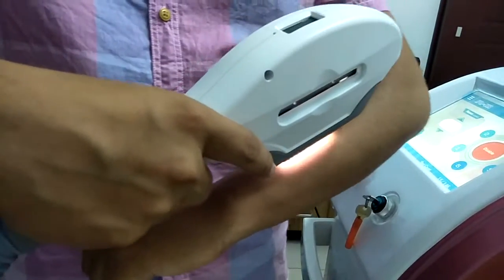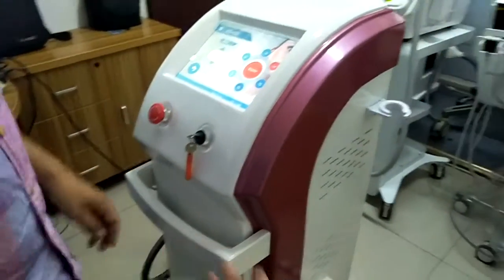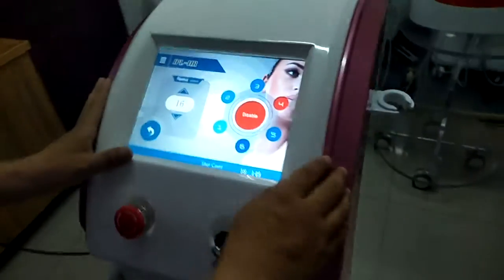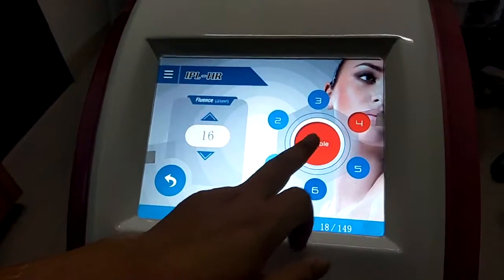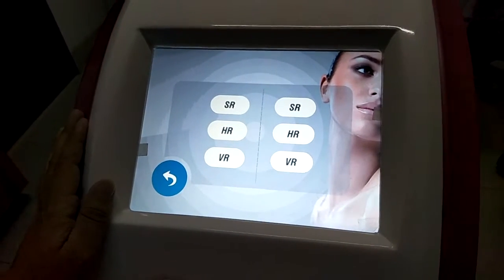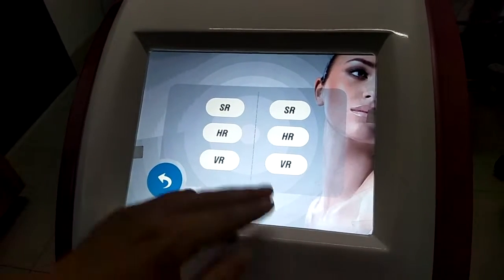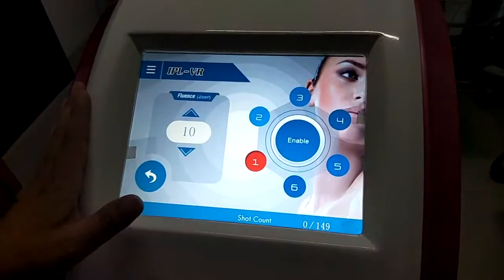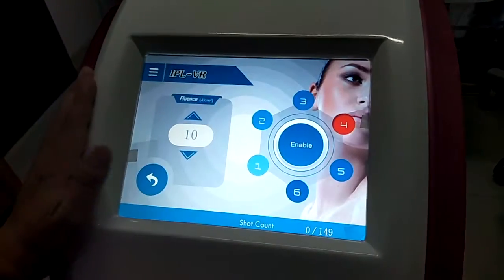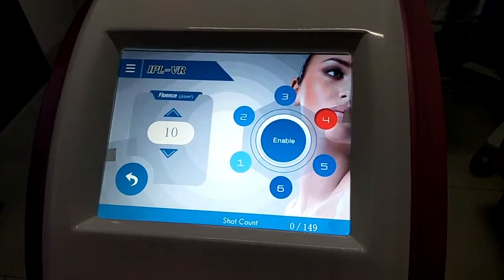Then we can use this energy to do the treatment. If you feel no sensation, you must increase the energy. If we want to stop the treatment, we can press disable and then return to the last page. One thing you should pay attention to is the VR function — VR function is only for skin types 1 to 4. It does not work for skin types 5 and 6.